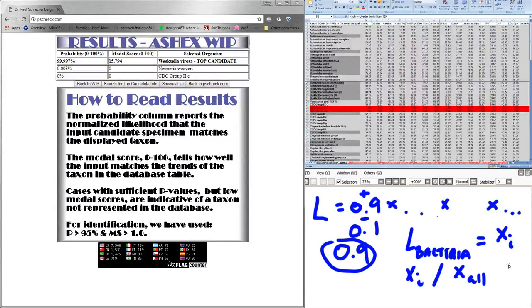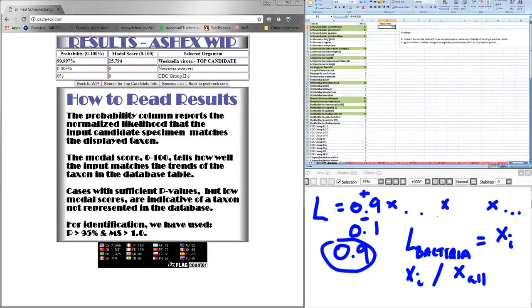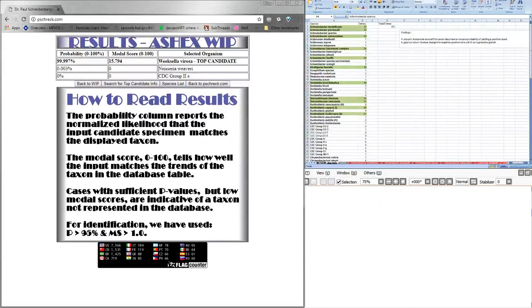So for example, there are some organisms that in 30 years of research, my dad only saw clinically once, right? And if it's in the database, if that's represented in the table, which in many cases it is, you can just look in the key info tab of the actual table itself and see, Achromobacter spanius, there's one entry, right? So if you filled in the table based upon that entry, you would find the correct result. However, there's one problem here, and that's why I have included the Wilson binomial matrix.